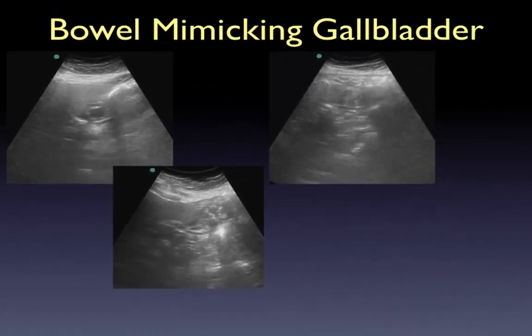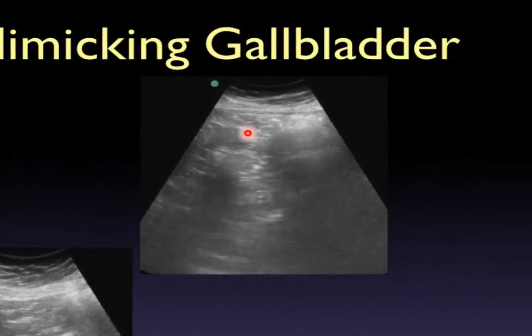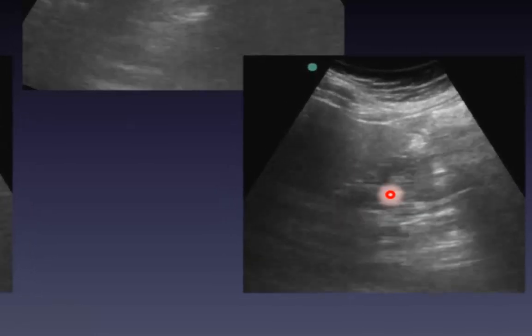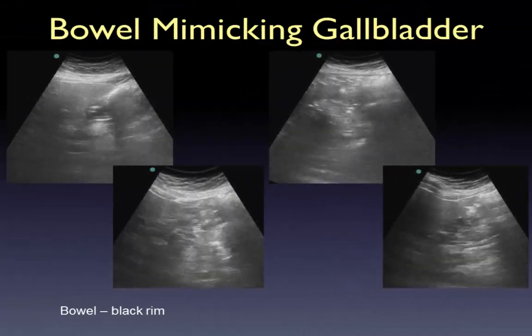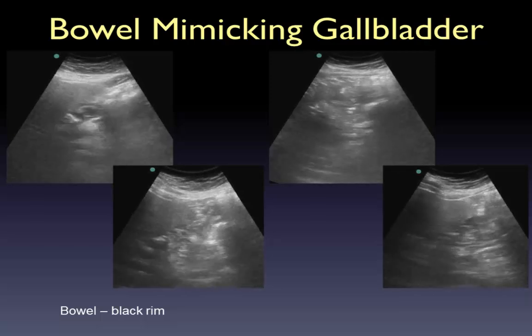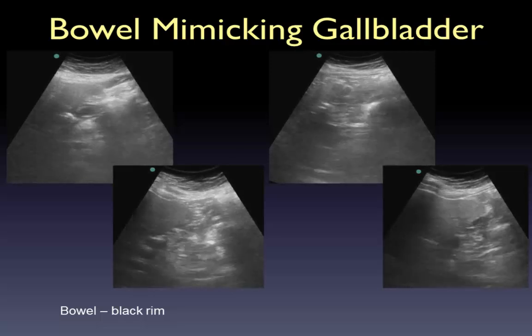And then what we notice is when we sweep a little bit more completely through this patient, evaluate them more completely, we start to see gallbladder right up in here, and then we see it again right here. So using some of our other landmarks like portal vein, main lobar fissure, hepatic parenchyma, and just by doing a full evaluation with big sweeps in the area, we can definitely identify gallbladder and avoid some of these mimics.